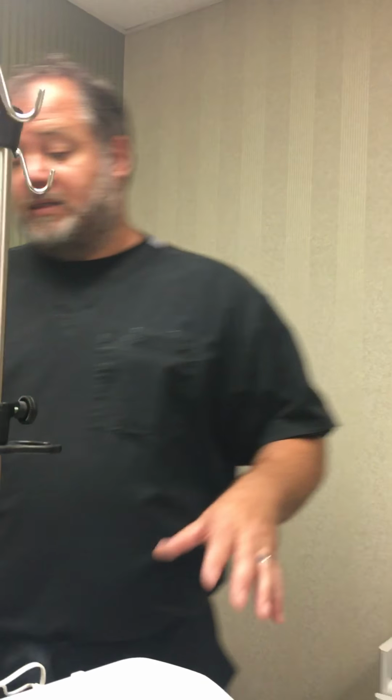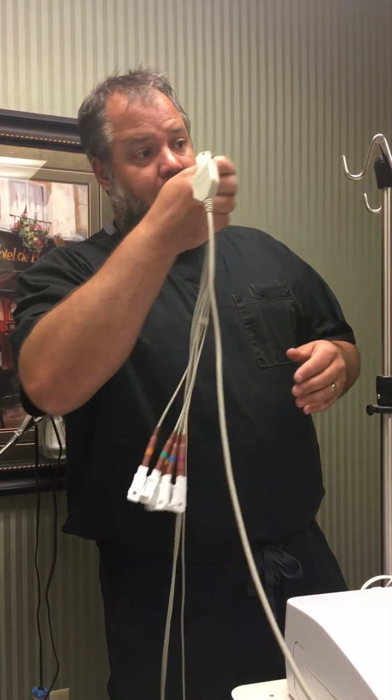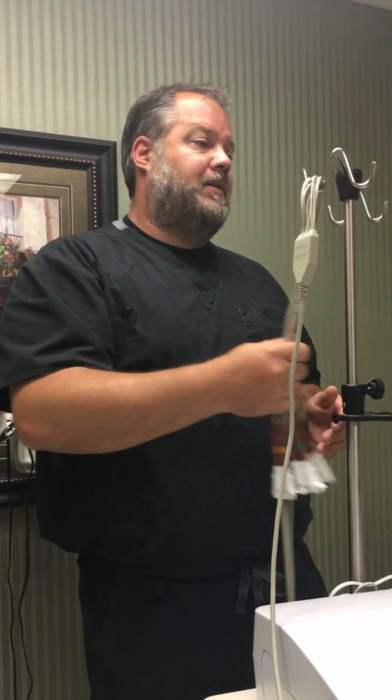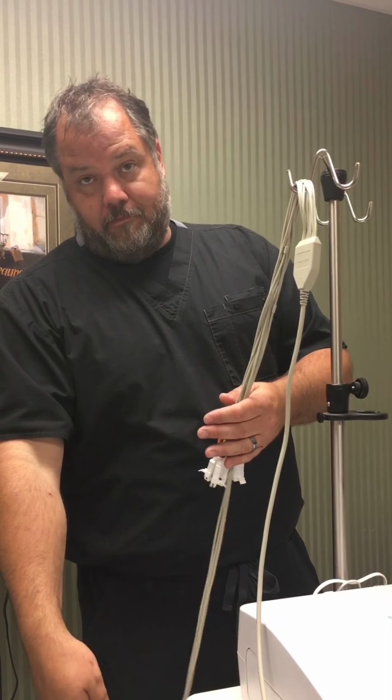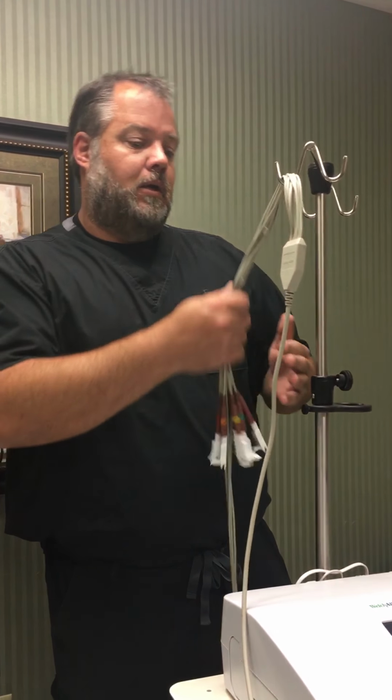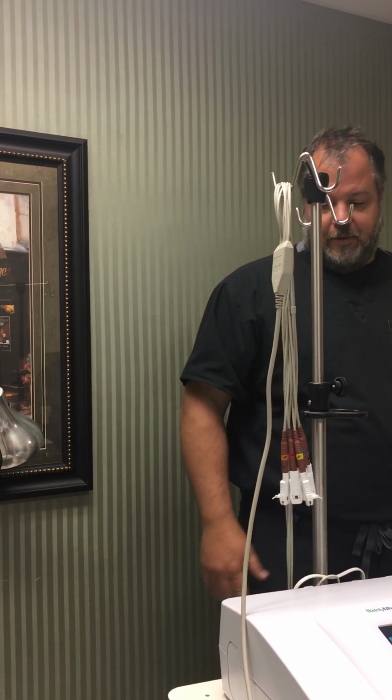Good? So yeah, and like I said, you guys don't have to practice now, but practice with this thing before you go out and do it with the patient. This is very nice that you have. The fastest way to destroy these cables is to let them dangle, drop under the wheel. So just keep them draped like this, and you should be fine.